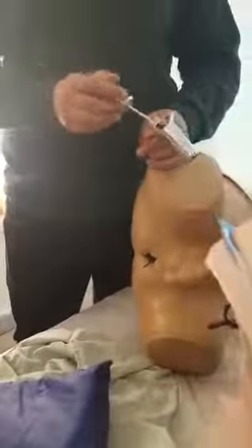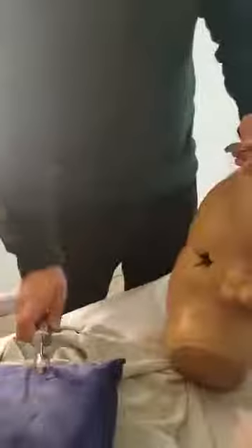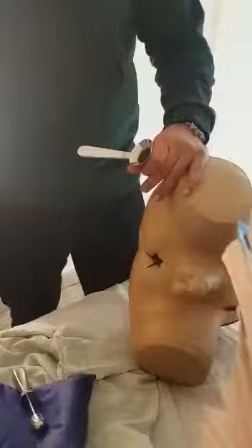Then you take out the obturator. You will squeeze some rectal mucosa in between. Take out the obturator, then you examine. You will put in the proctoscope, you need to get a light source, then you remove the scope.